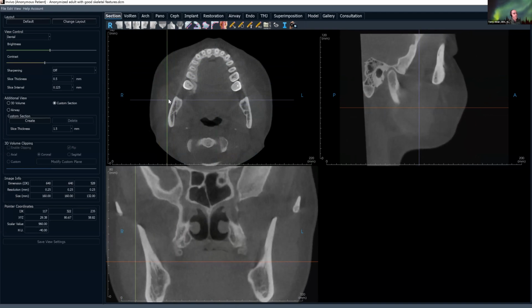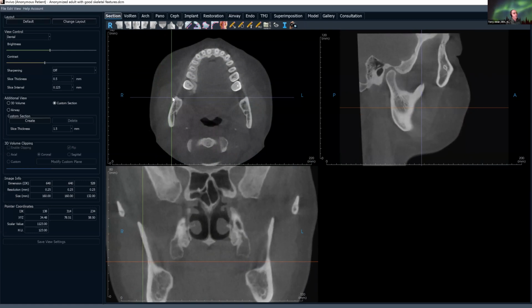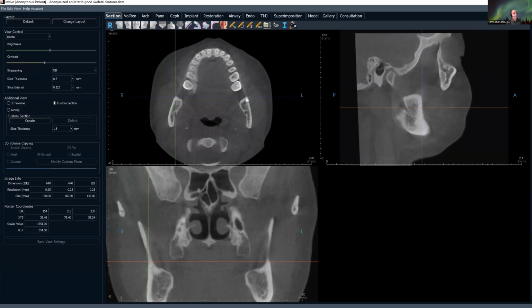an important structure that's very delicate. I think I have a good one in this case here. I'm scrolling from right to left, right here. Let me use my mouse wheel here. This right here is the stylomastoid canal and foramen. It's very tiny. You don't always see it, but this is where the facial nerve lives, and this is where it exits right here. So the facial nerve, your cranial nerve number 7, exits here.